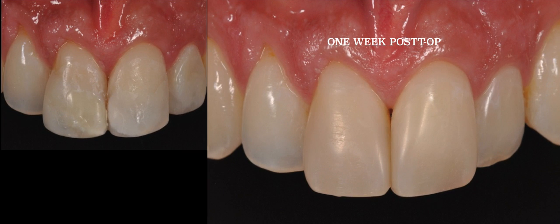On our final slide you can compare the before and after photos. I want you to look closely at the photo on the right and how the composite tooth interface is completely invisible.